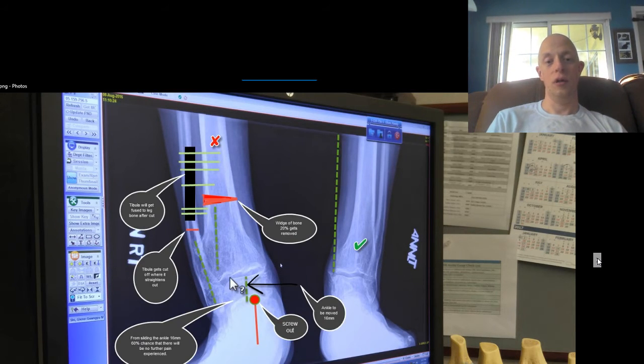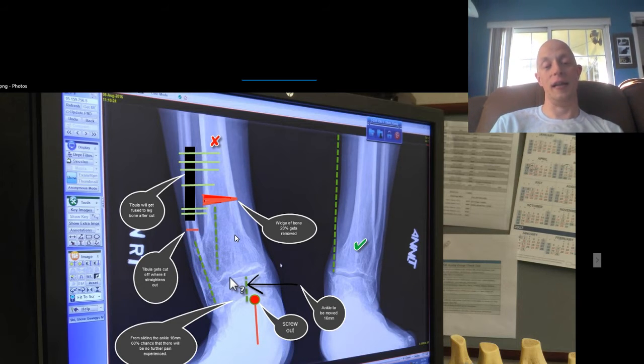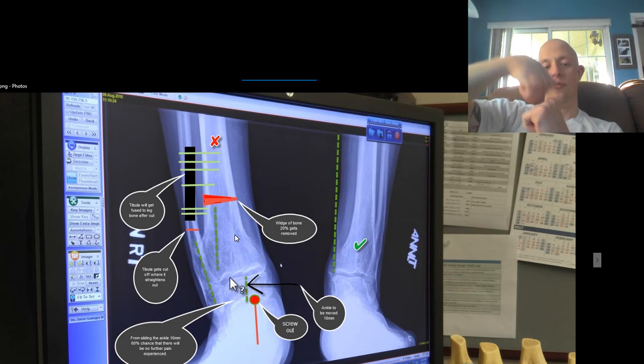We're going to switch over to — this is basically a really good outline with a nice little Photoshop of the plate that would be inserted. Anything with a dotted line would be cut here on the left side of the tibia and the wedge that would be placed out. And basically it would be sitting flush like this, so to speak.